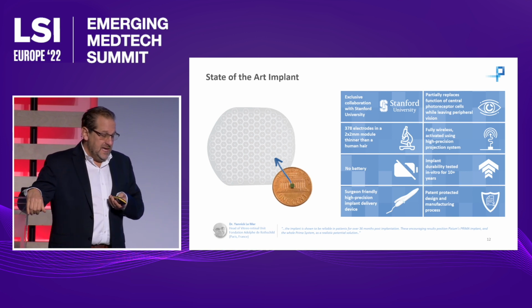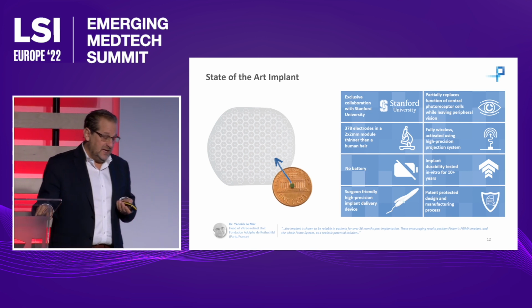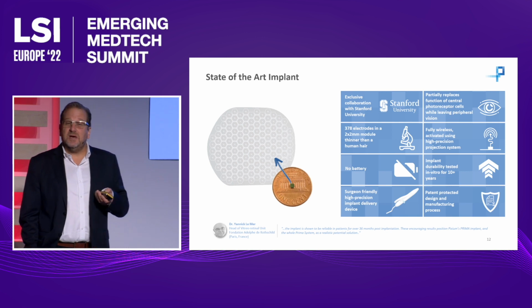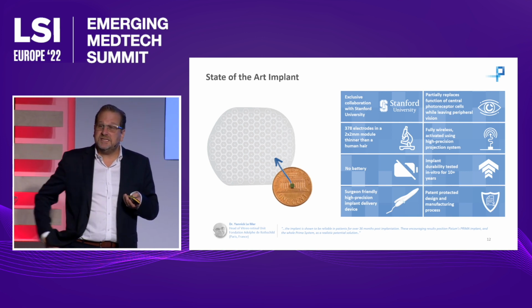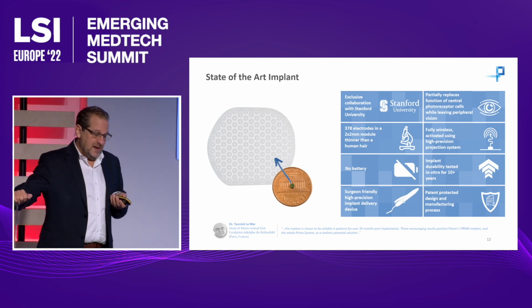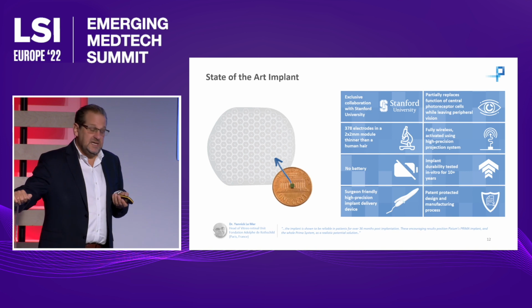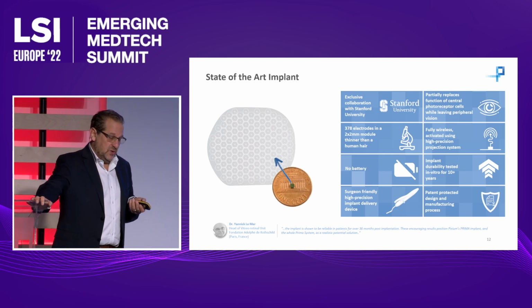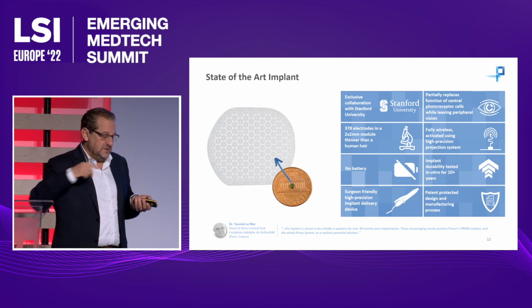for the implant. It is thinner than a human hair, and it actually is injected subretinally with a proprietary injection device, which allows the surgery to be done minimally invasively, inpatient, outpatient, under general or local anesthesia. The average operating time is about an hour and a half. The in vitro testing has shown 10-year lifetime of the implant, and in accelerated aging, we're at about 20 years. Average age of implantation of these patients is 72 years old.